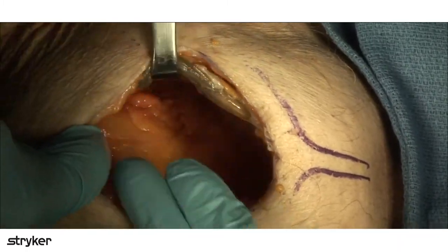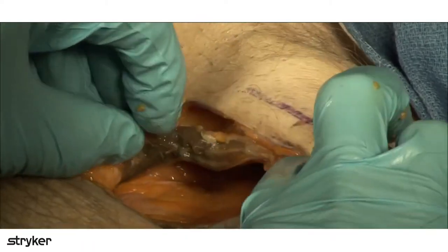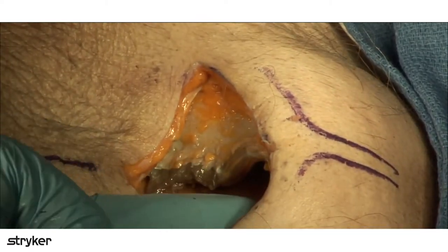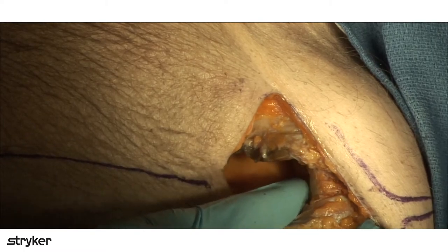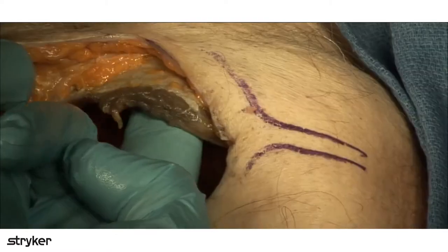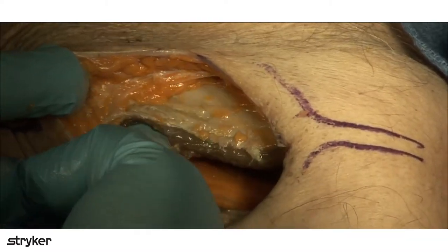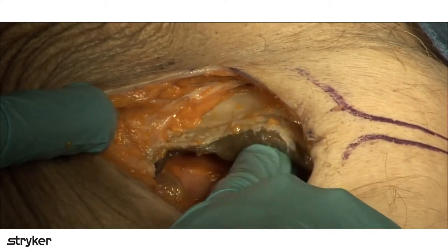Number three is this. When you first come in and you get into the retropubic space of Retzius right here, you're going to take your finger and come in underneath the rectus muscle like this and break down any adhesions between the bladder and the undersurface of the rectus.